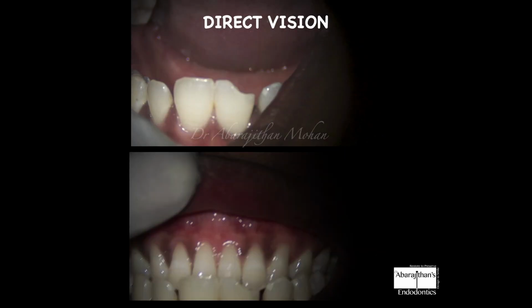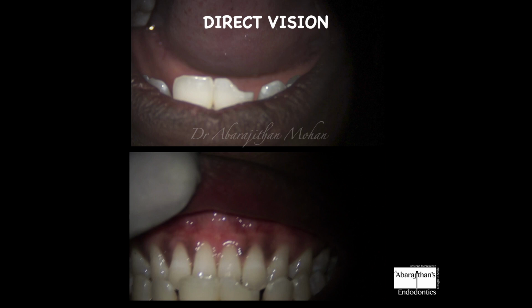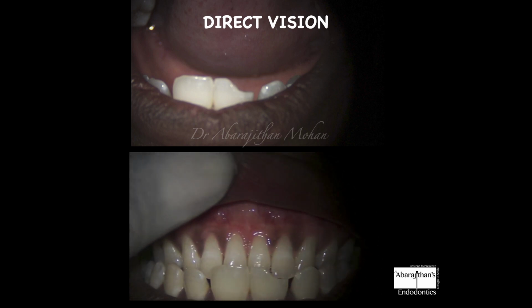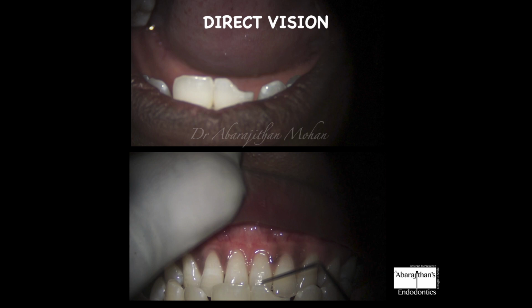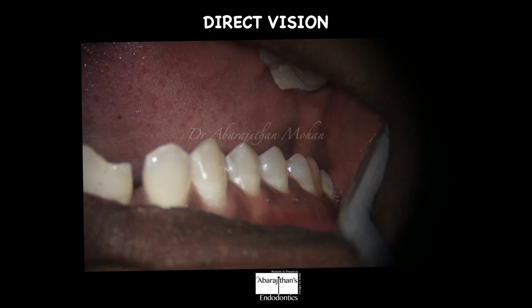So the concept is simple. Whatever you can see directly, do it with direct vision. So the labial surface of the upper anteriors or the labial surface of the lower anteriors can be seen directly. So any restoration or any procedures that you perform in this aspect of the teeth can be performed in direct vision. You can see here again the occlusal surface to an extent and the buccal surface of the mandibular right quadrant is pretty visible. So procedures that are done here like tooth preparation, veneer preparations, and again the maxillary teeth, the buccal surface, these areas can be visualized directly.